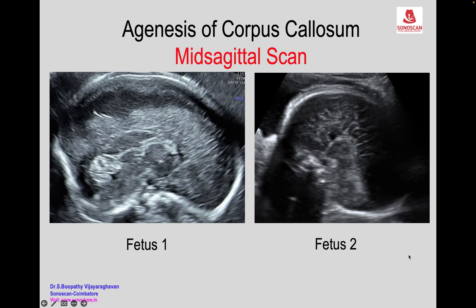Hello everyone, this is the next case scenario in Image to Diagnosis Fetal Medicine. These are two images of midsagittal section of two fetuses diagnosed to have agenesis of corpus callosum.